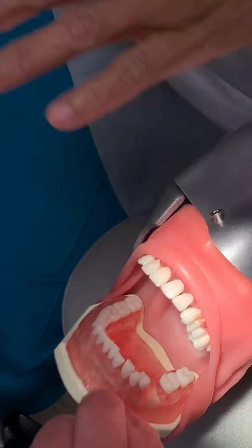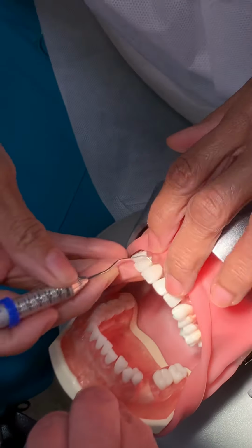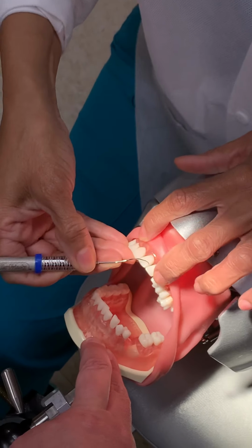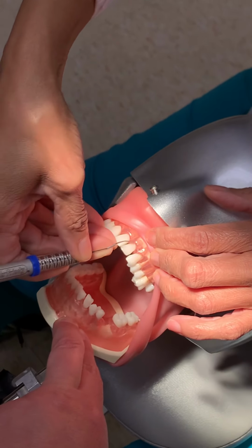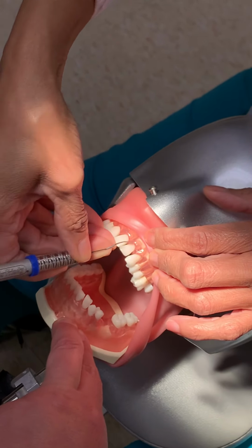And we talked about also keeping your wrist straight. So now I'm going to go on around to maybe like 11:30ish, somewhere here, to keep my wrist straight. As I get to this one, my wrist is a little high, and then I come around to 12 o'clock. So this is when we can use this 11 to 1 to make sure our wrist is parallel. All about ergonomics.